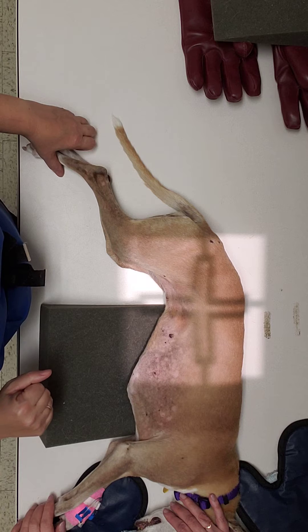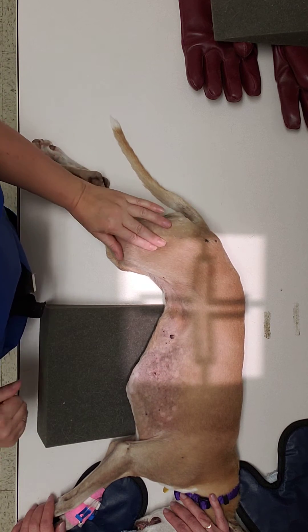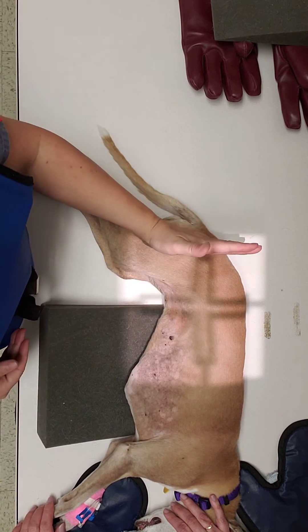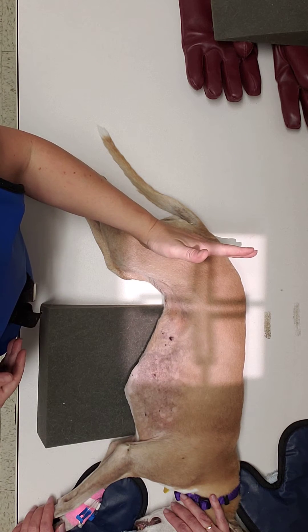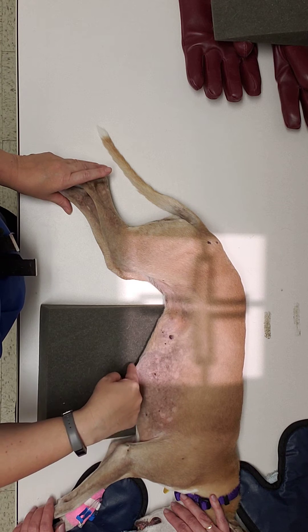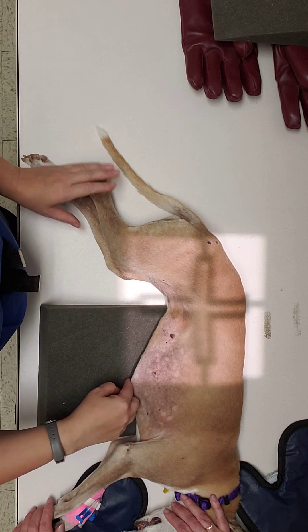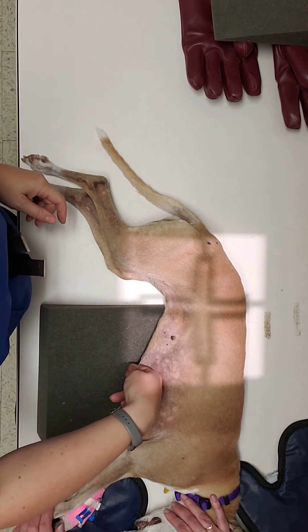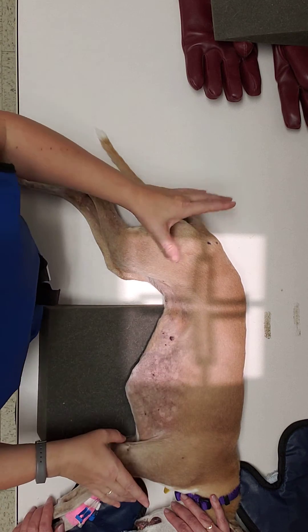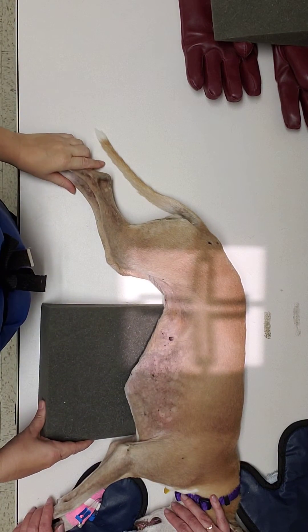Our edges for our collimation are going to be our greater trochanter, which you can feel on all of her joints and bones. Her greater trochanter falls about right here. And you want to be about two fingers widths below your xiphoid process. Her xiphoid process is right here, her last rib's right here, and two inches down is about right here. That also equals out to be about her ninth rib in this area. So I'm going to go ahead and shrink this down just a little bit for her, and that should be just about right.